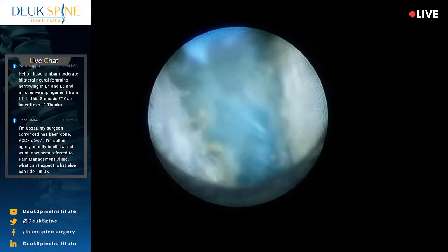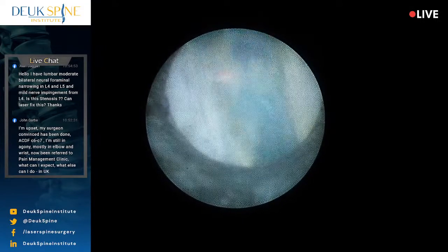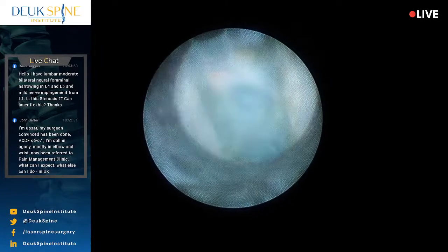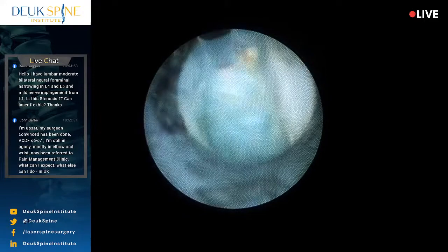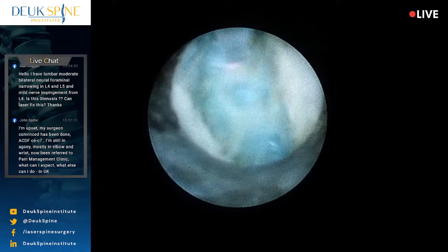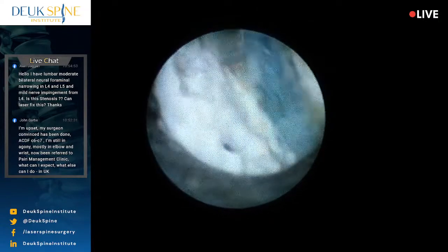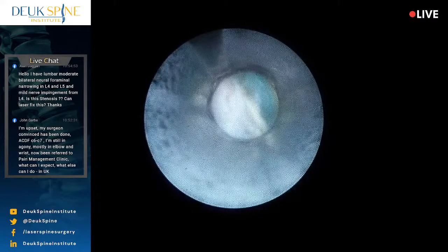the dura, and here the posterior longitudinal ligament. So why is there PLL here and not here? Well, the PLL is not across the entire back of the disc. It's just in the middle part. That's dura right there. That's dura, okay? I made a hole in the PLL just to look and see if there was any herniation behind it. There's none. Just don't want to make a hole in the dura, okay?